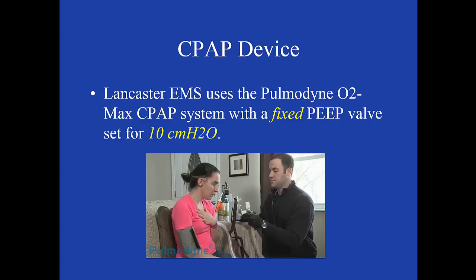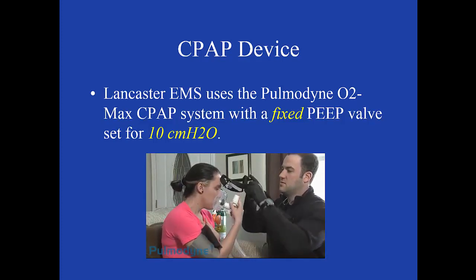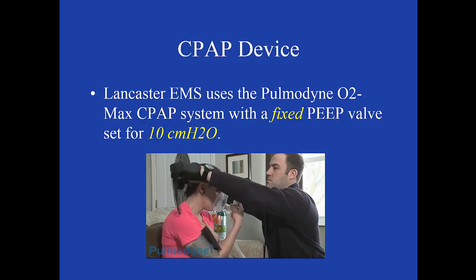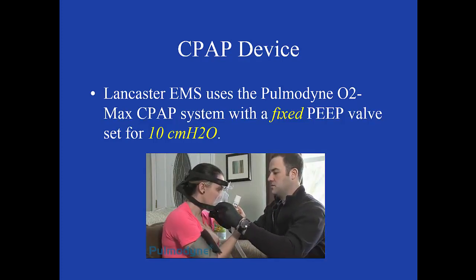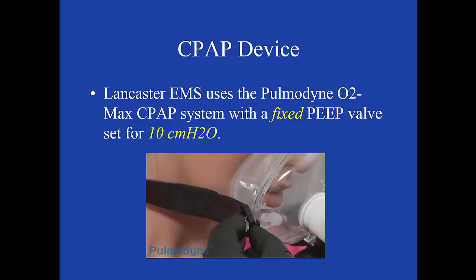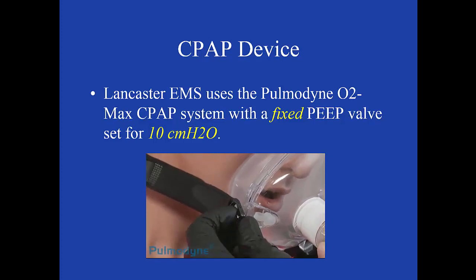Once connected, try and coach the patient to take the mask and hold it to their face. This helps reduce patient anxiety and improves patient compliance during their treatment. Fit the mask head straps accordingly over the patient's head and clip the bottom straps to the bottom of the mask. The top and bottom straps can be adjusted using the Velcro tabs.